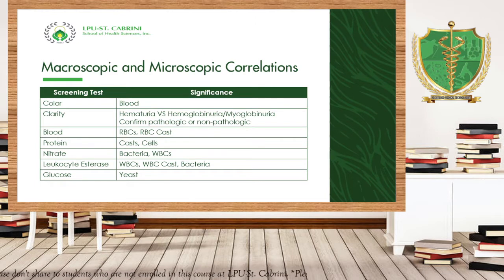However, no, it must be confirmed or further analyzed if the presence of blood in the urine is pathologic or non-pathologic. Because as we all know, another reason rather of having a red urine or having the presence of blood in the urine is maybe due to the menstrual cycle, most especially in women.